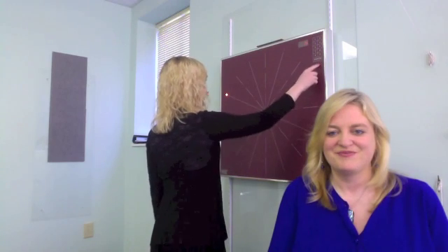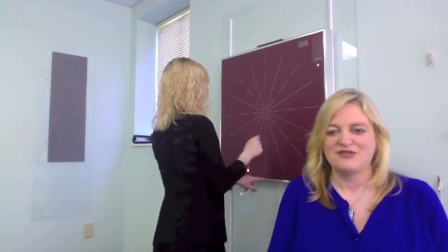One of the very fun activities that we use in vision therapy is called the Wayne Saccadic Fixator. This is a device that can be used in many different ways.